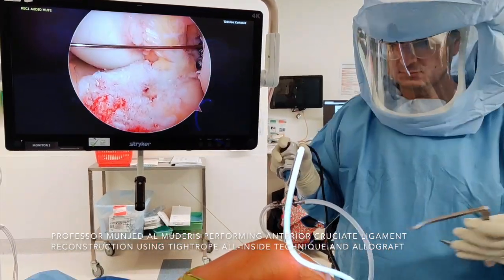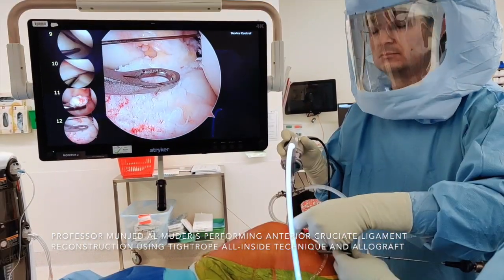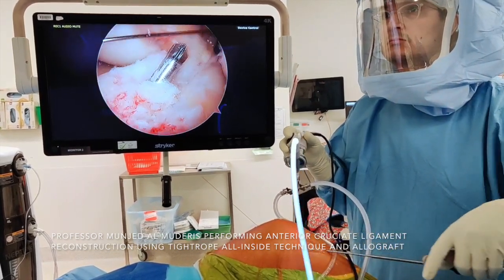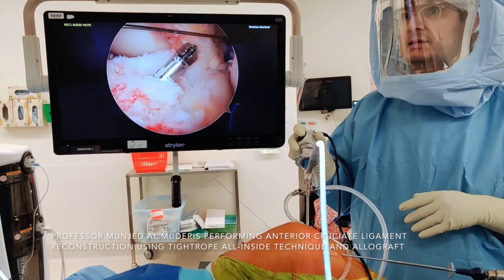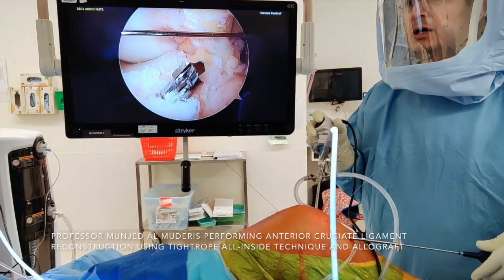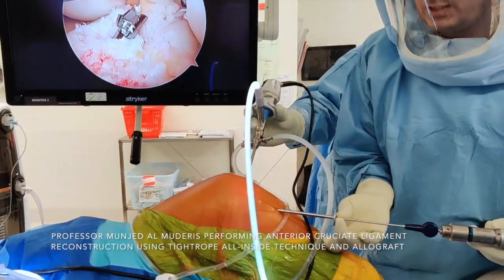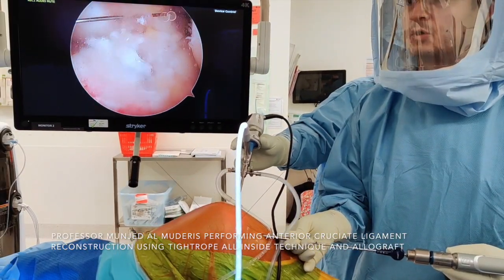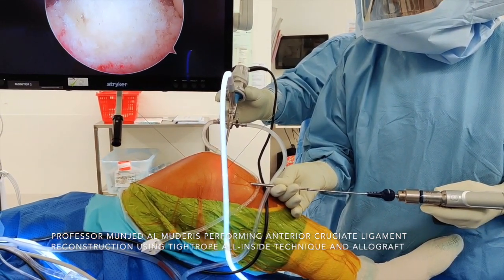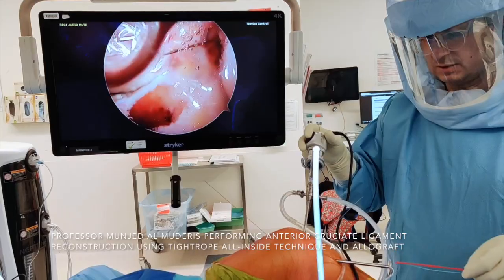The next step is to perform the tibial tunnel, which has to be in an anatomic position. I use the same size flip cutter. The flip cutter is coming out exactly at the stump of the ACL. I secure the trocar and then flip the flip cutter. I do a full revolution of the flip cutter by hand to make sure it's free. I use the same depth marker to identify the amount of drilling, going backwards again in forward revolution of the drill, the same distance as measured on the graft, or half a centimeter longer.